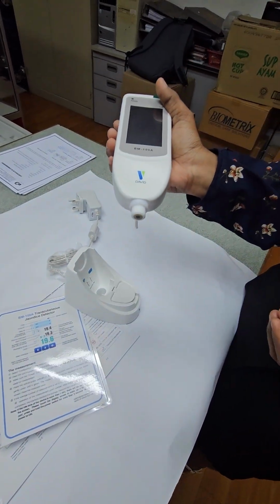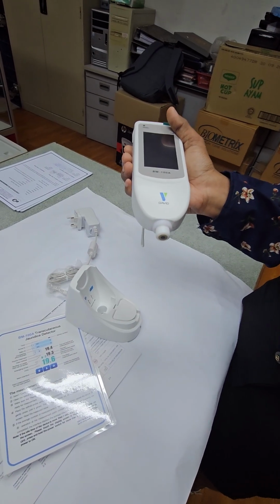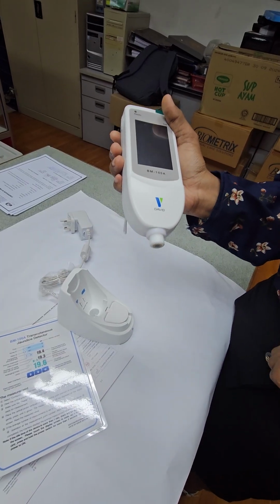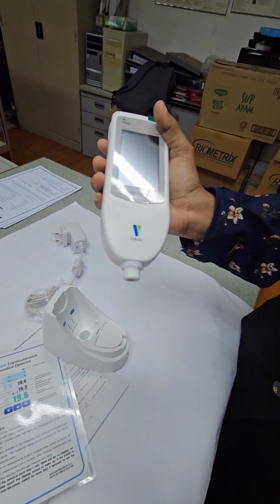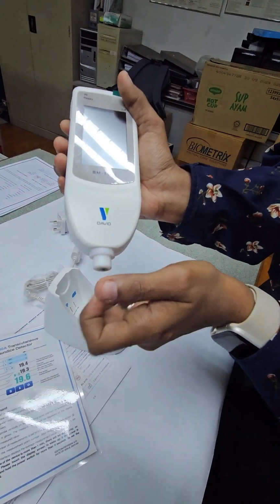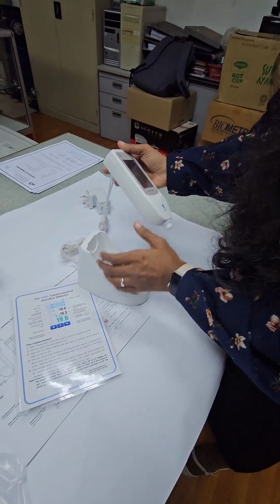I think sometimes it is erosive. I think they put some water will do, right? Oh no, it's better to use an alcohol swab. Soap water, no. Yeah, alcohol swab only, basically not touching the inside. The whole probe, only alcohol swab. Okay, understand.